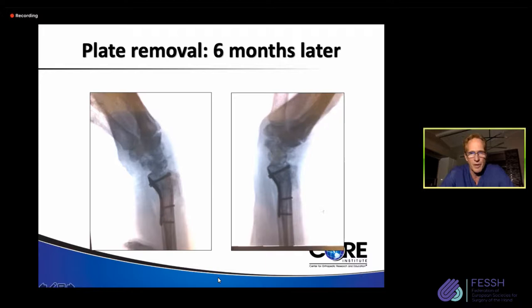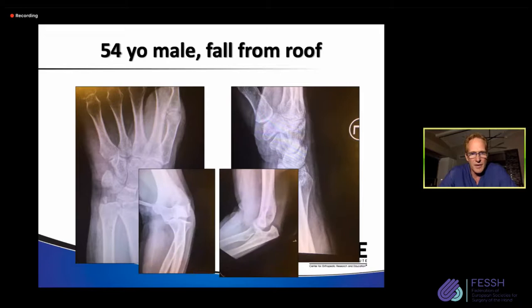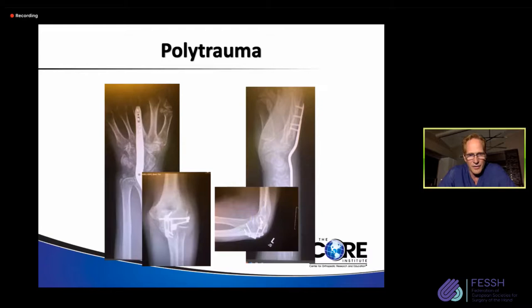54-year-old male fall from a roof. Again, this is something that, hey, you may want to consider fixing with fragment-specific fixation. I don't know if this necessarily needs a spanning plate, but he also had this ipsilateral injury to the elbow, which means we're operating on both. So polytrauma would be a kind of an indication to span, fix this quickly, make it durable so that he can do what he wants to do with the arm and rehabilitate the elbow, and we do something cute there. That's a whole other topic to talk about later.